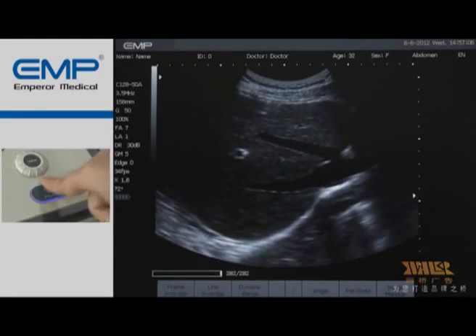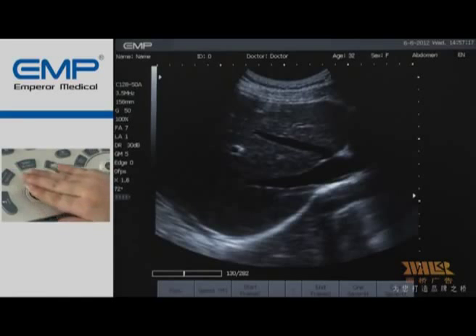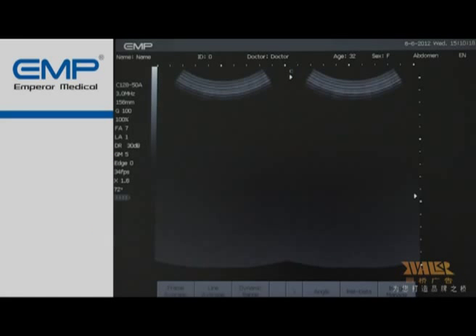Press the Freeze button to freeze the image, and then move the trackball to the certain frame you want to check. Press the B, BB, BM, or M button to easily change the scanning mode.